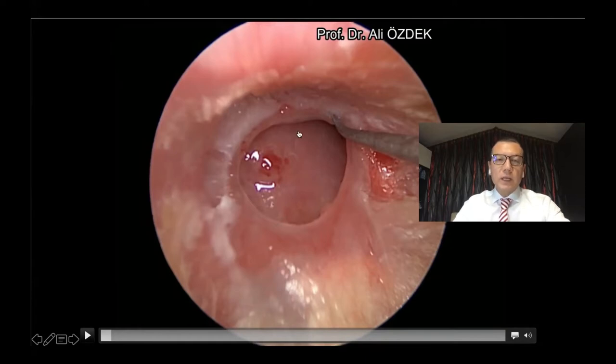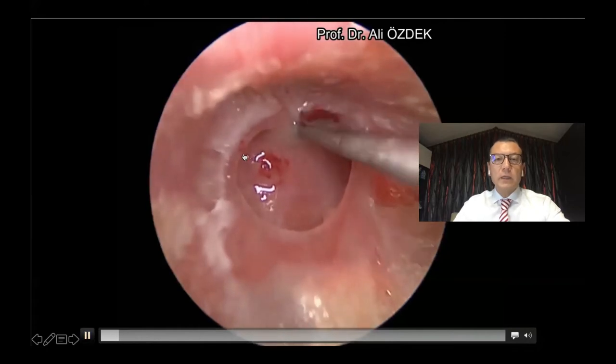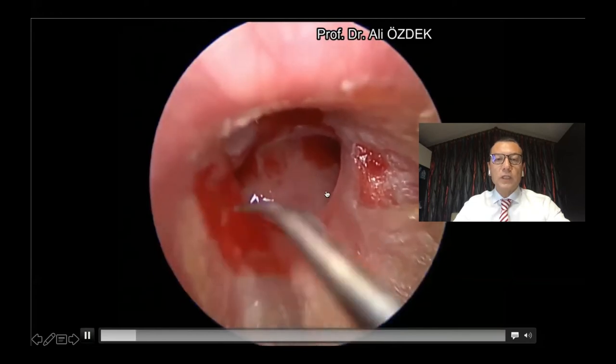When we start the surgery, first of all, we de-epithelialize the perforation edges to stimulate wound healing.